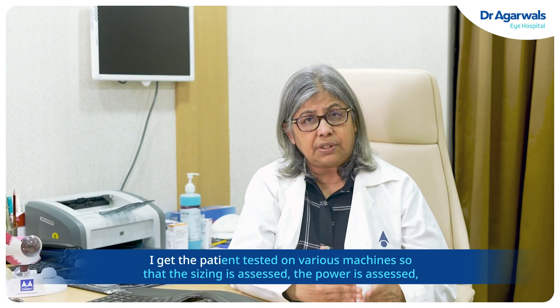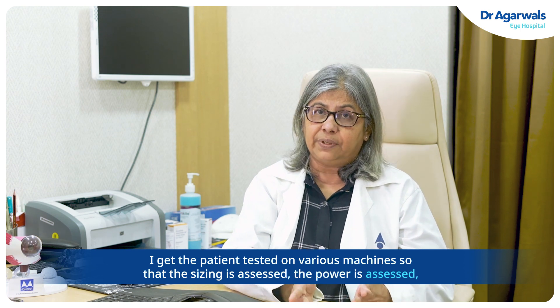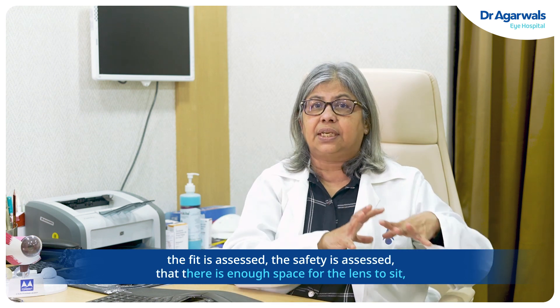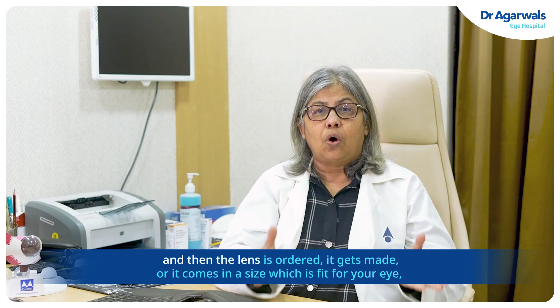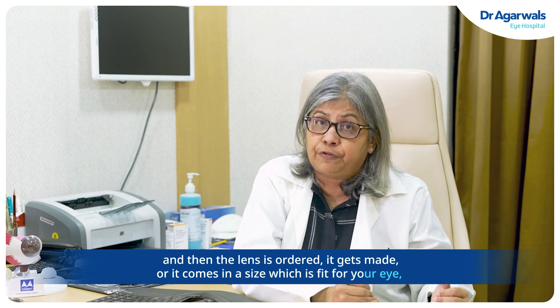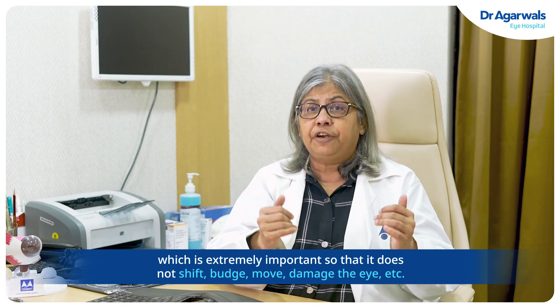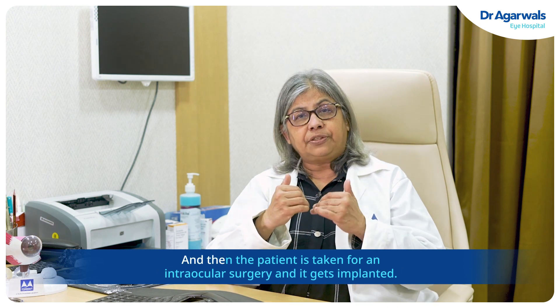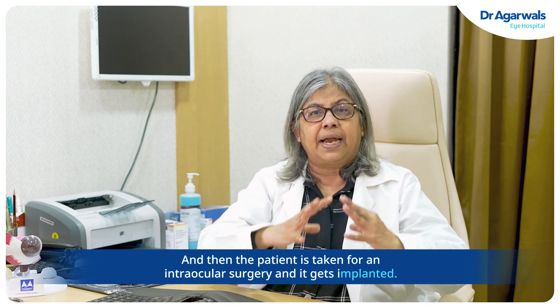I get the patient tested on various machines so that the sizing, power, fit, and safety are all assessed — ensuring there is enough space for the lens to sit. Then the lens is ordered; it is made or comes in a size that fits your eye exactly, which is extremely important so that it does not shift, budge, move, or damage the eye. Then the patient is taken for an intraocular surgery and it gets implanted.